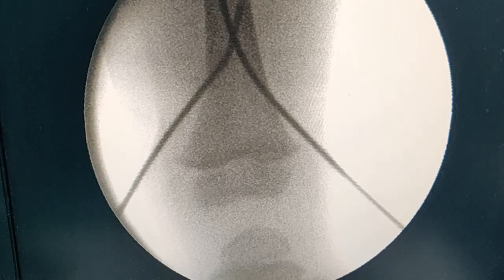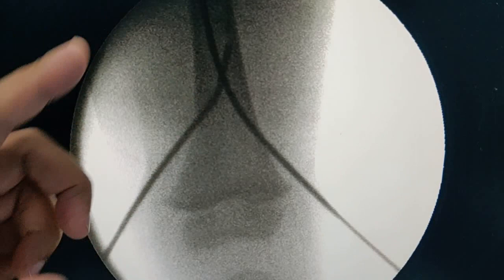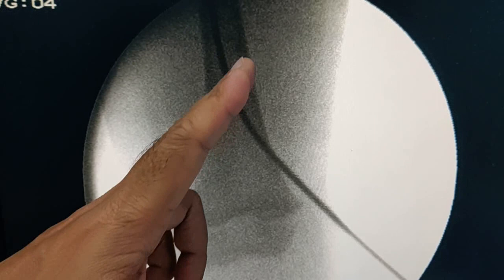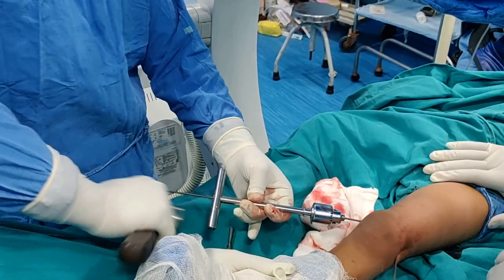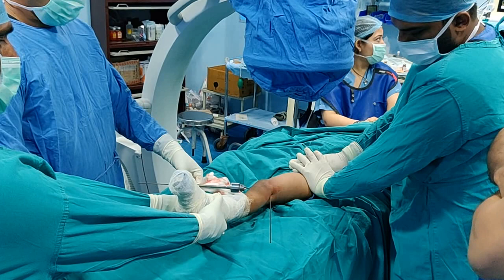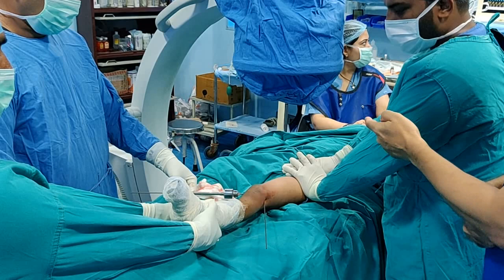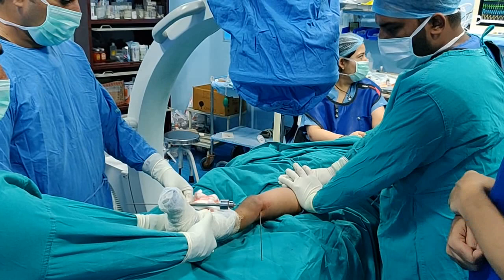Apply the same principle on the medial side: go straight, then angle it. When hitting the lateral cortex and wanting the nail to go up, your curve must be oriented so that when you gently tap it skids on the lateral cortex and travels up. To negotiate the TENS nail and reduce the fracture, gentle traction is usually all that is necessary. Dr. Saurav provides proximal traction, Ramesh provides distal traction, and Dr. Rashid gently taps the nail. Most times this goes without problems, allowing a closed reduction without any open surgery.